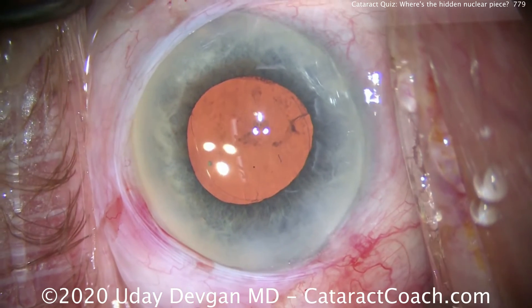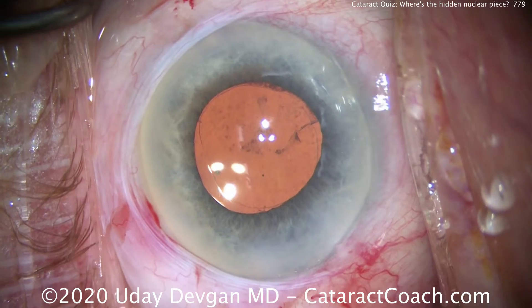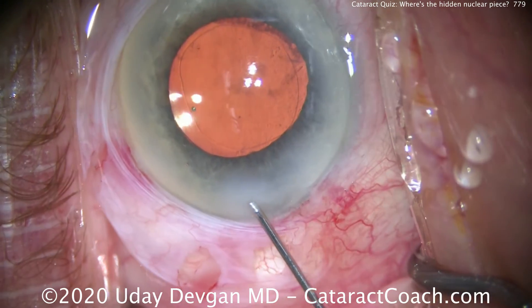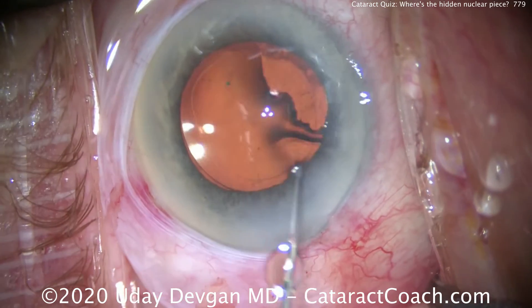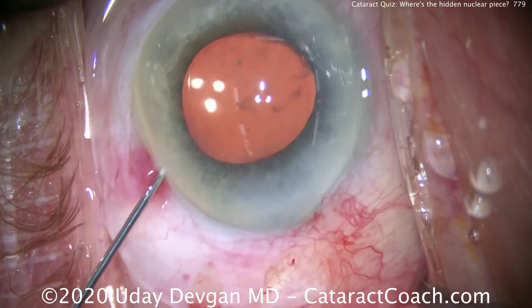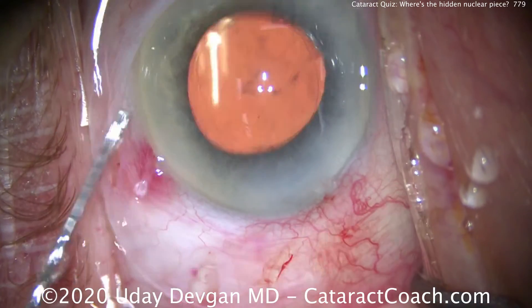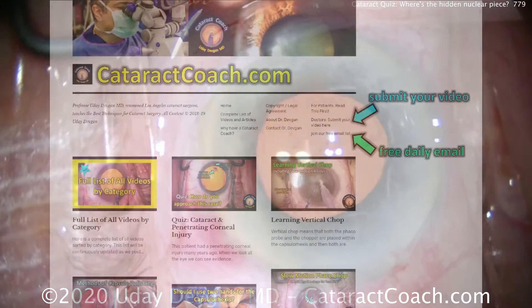So interesting case. Remember, in a patient like this — he's 96 years old — there's a lot of arcus senilis. Especially with a blue iris, you can have a piece of nucleus hidden in the angle of the eye. Because of the light-colored iris and the arcus senilis, it's almost completely invisible. We want to use the benefit of high flow and angle sweep to make sure we've removed all these pieces. I'm happy to say the patient had a beautiful outcome and was very happy with the results — he said he just wished he didn't wait as long.